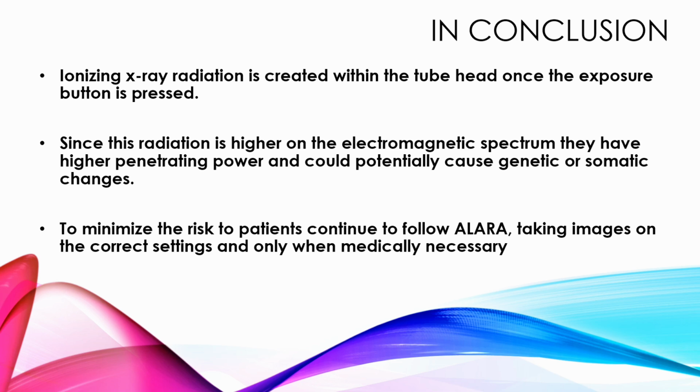Ionizing X radiation is created within the tube head once the exposure button is pressed. This means that when we come in the dental office in the morning, we can go ahead and go through all of our operatories and turn on our dental X-ray units for the day without worrying that we will be exposed to X radiation, because we know that nothing happens until we push that button.